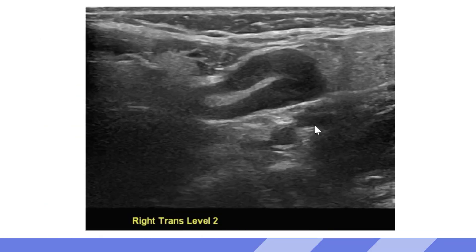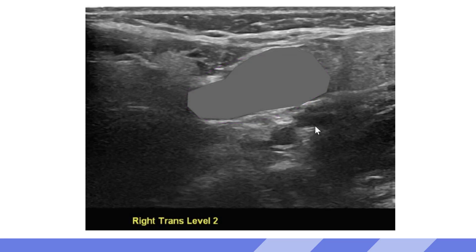Here's another example of a normal lymph node found in the neck. We have mostly an oval shape to the lymph node. We're seeing that the cortex is hypoechoic, symmetrical, thin, and it surrounds a fatty echogenic hilum. Now if we were to put color on this lymph node, we would expect to see the vein exiting and the artery entering at the hilum.